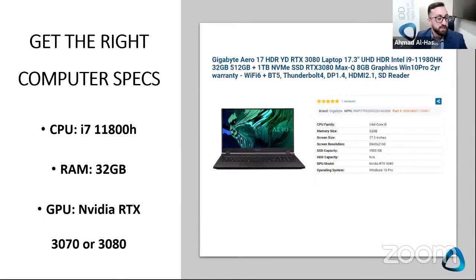You can export the scans in HD, yes. Now, cost-effective way. Right, so with the cloud storage, how do you store these scans? I think, honestly, one of the most cost-effective ways is just to use the Medit one. It's $1 US per month for 10 terabytes.